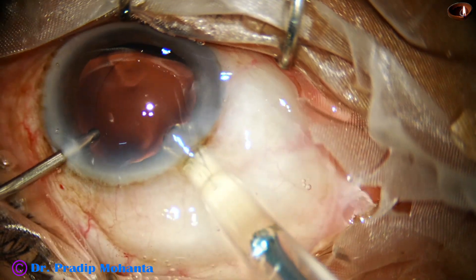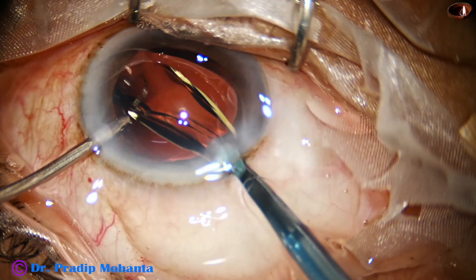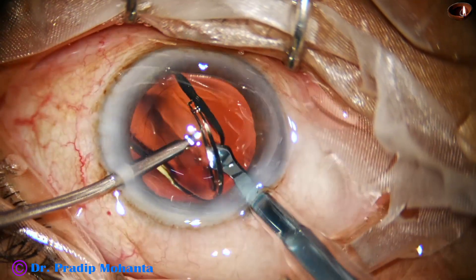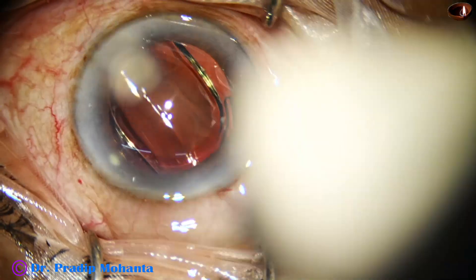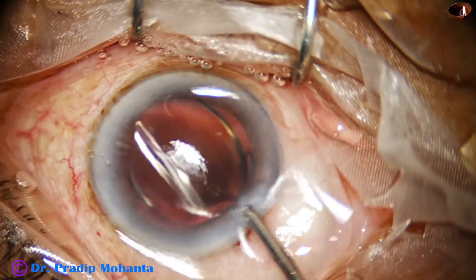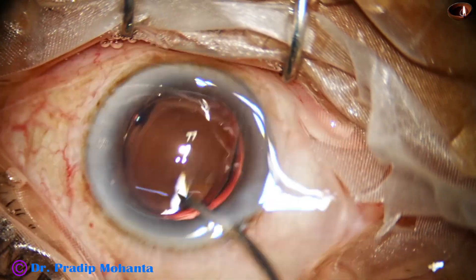And now this is the implantation of a hydrophobic acrylic single-piece monofocal intraocular lens. The lens has gone into the capsular bag.